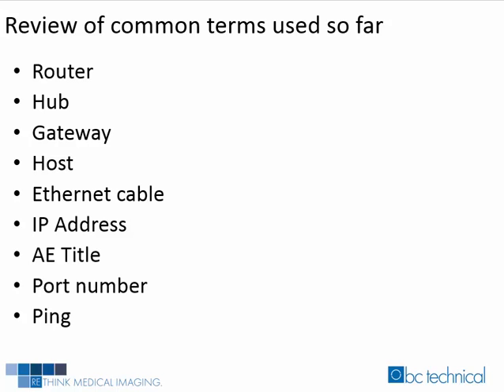Gateway. This is a term used when a device like a router connects two different networks, for example, 192.10.100.1 or 10.10.100.1. Host. Host is another term used for a medical device connected in a network. Some examples of hosts are cameras, printers, and PACS.